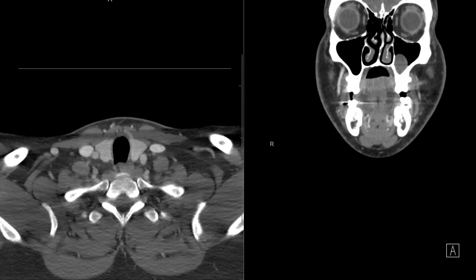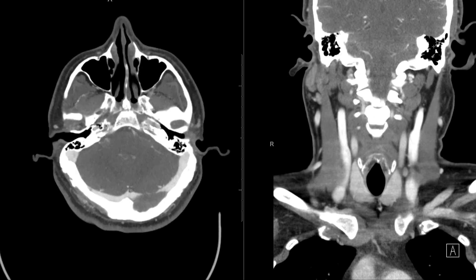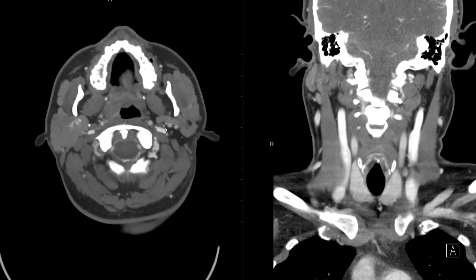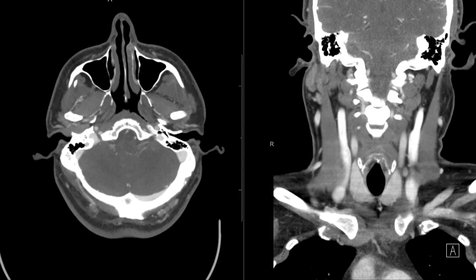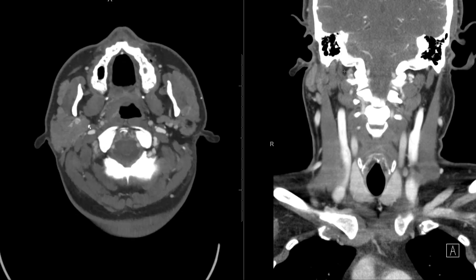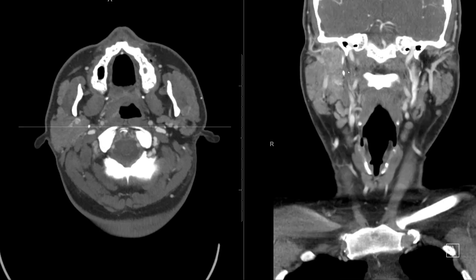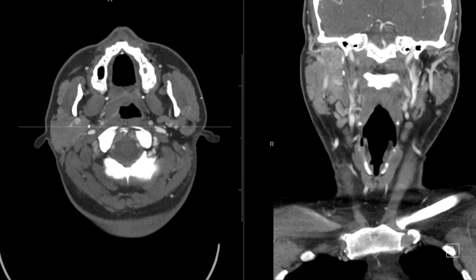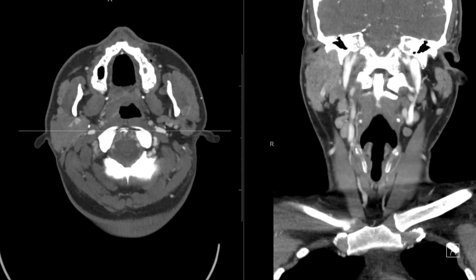Lastly, the styloid process. It's going to be in the region of the mastoid bone. Here is the styloid process on the left side, and on the right side it's right here — fairly short and not very well ossified in this patient. On the coronal plane, you can see it here as the styloid process, partially calcified on both sides.